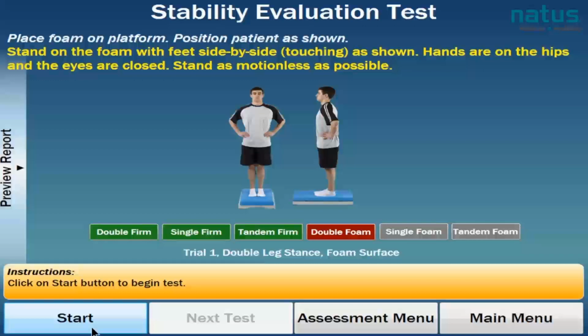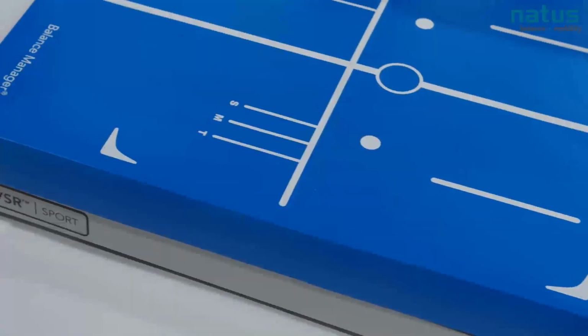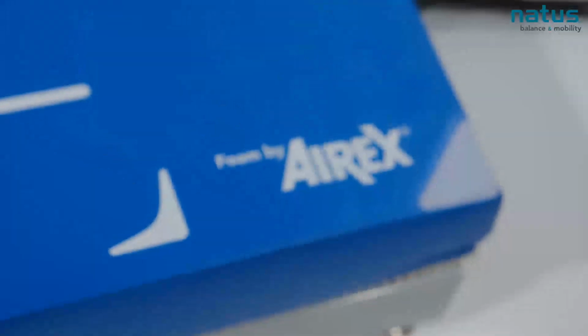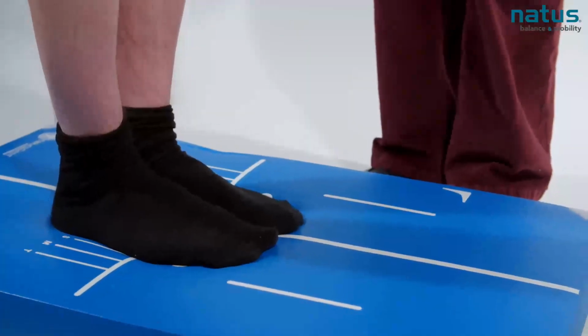Conditions 4, 5, and 6 on the SET protocol are identical to conditions 1, 2, and 3. The only difference is that we are going to do the next 3 conditions on a foam pad. What we've done is we've placed a non-slip surface underneath the foam. This is essential for safety. We're now going to do the same thing we did in condition 1. You're going to stand on the force plate, on the foam, with your feet right next to each other. That's great. Your hands are on your hips.